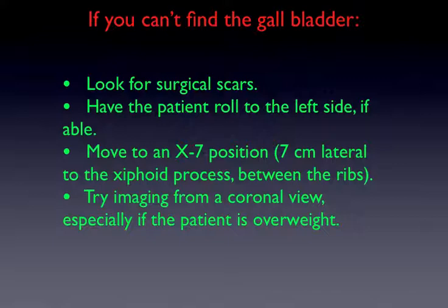If you can't find the gallbladder, there are several things to do. In days of yore, it was very easy to see that the person had an open cholecystectomy and there was a huge scar. With the advent of laparoscopic cholecystectomies, sometimes the scars are hard to find. So be sure that the patient has not had a cholecystectomy.